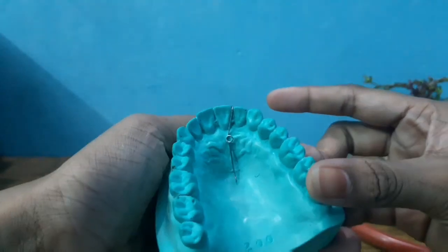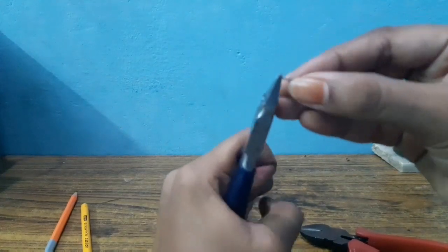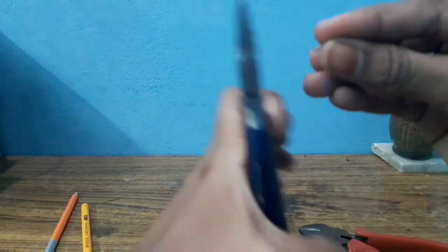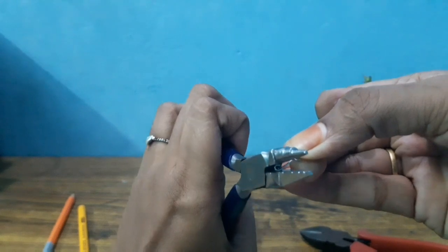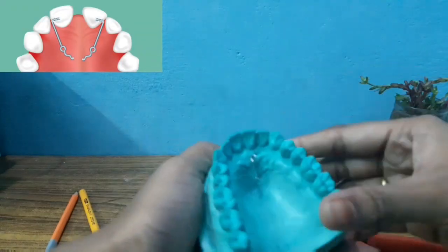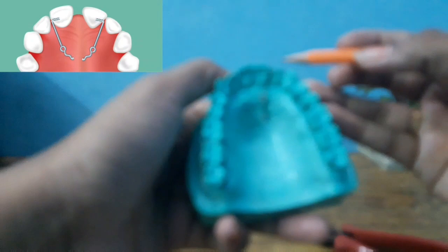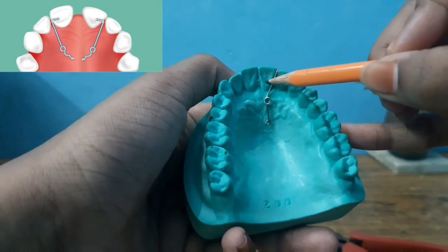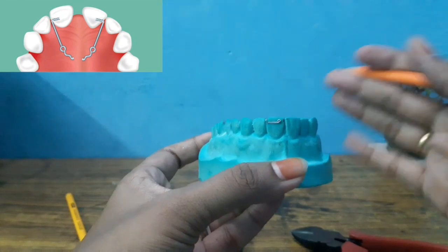It is perfectly done. Check all sides for adaptation, cut excess wire, and cut it. Now we can cut the tag. Make sure you close it tightly. Our fingerspring is now ready. Now let's look at the important points of the fingerspring. First, the coil — the coil is opposite to the direction of tooth movement. The coil should be perpendicular to the direction of tooth movement, and the coil should be placed along the long axis of the tooth to be moved.